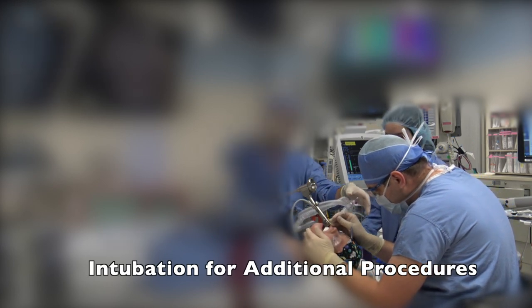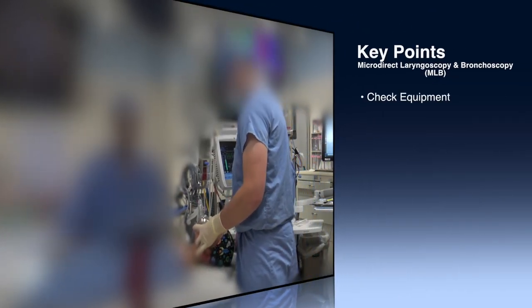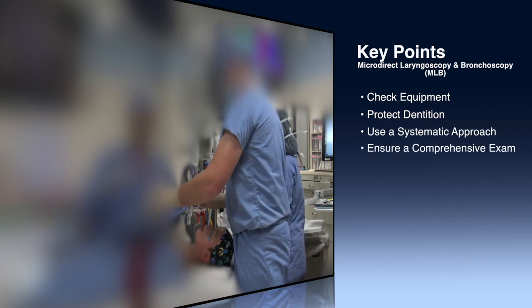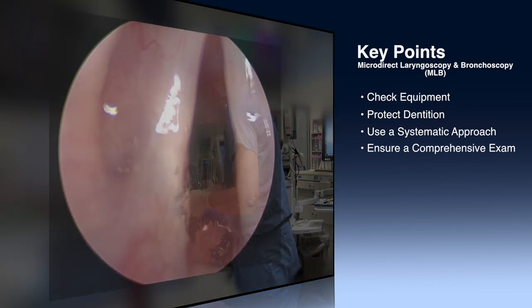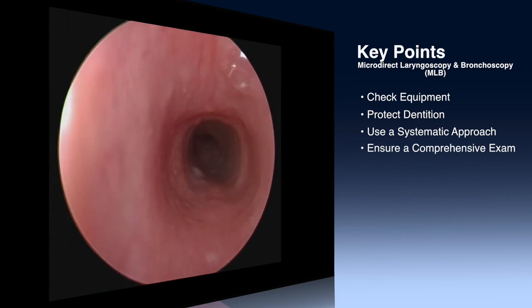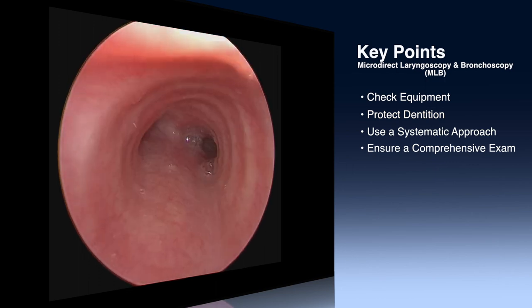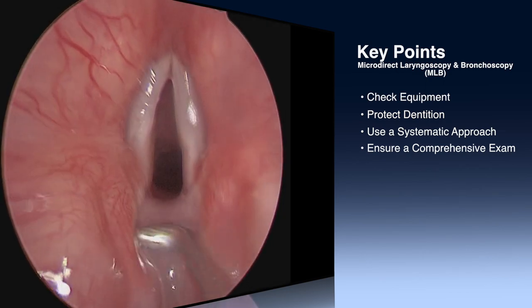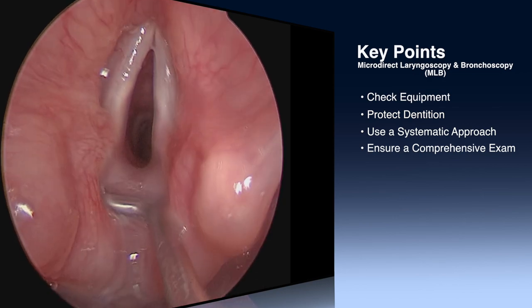The chest support and laryngoscope can be removed and the depth of the anesthesia tube is checked. Important key points: always check the equipment before the patient enters the operating room. Always use a sponge or tooth guard to protect the upper teeth or gum. Examine the airway in a systematic way from proximal to distal and then carefully again as the telescope is withdrawn. Finally, make sure to perform a complete airway exam including palpation for a laryngeal cleft and sizing of the airway.